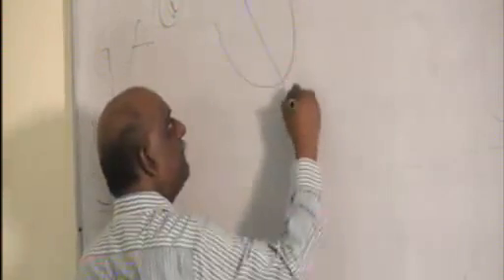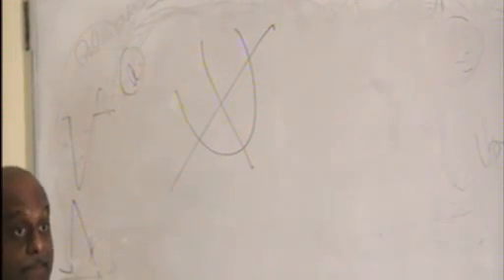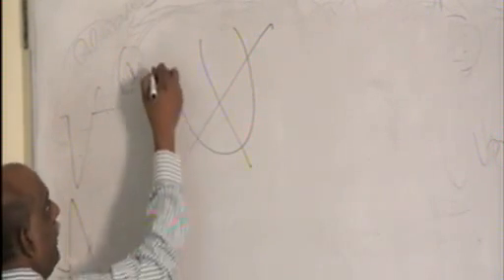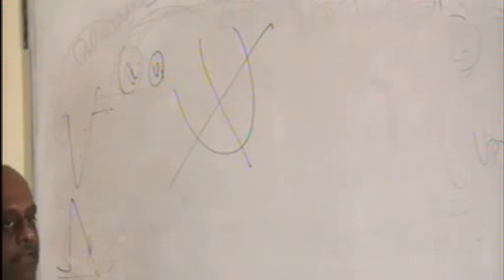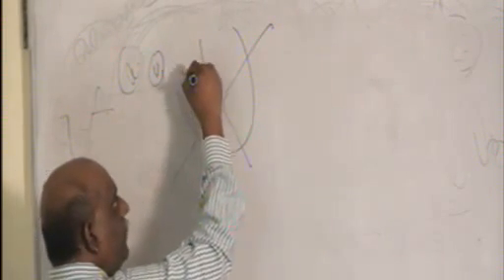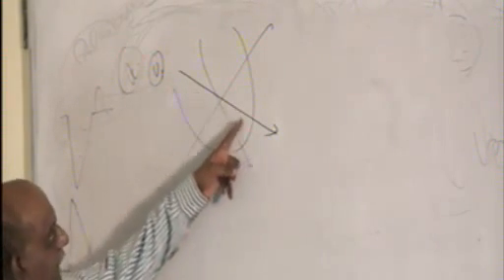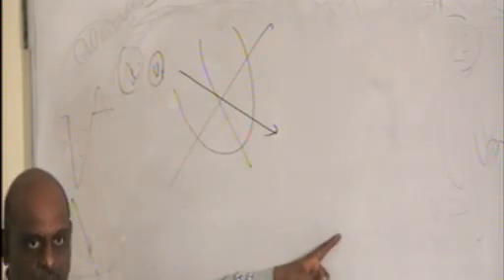So doctors, we are talking about the P wave, left and right atrial enlargement. We have lead V1. What is the speciality of lead V1? It is placed on the right side. Then we have lead 2. What is the speciality of lead 2? The axis of lead 2 passes from right to left and from up to down.